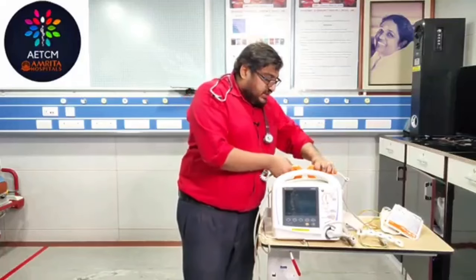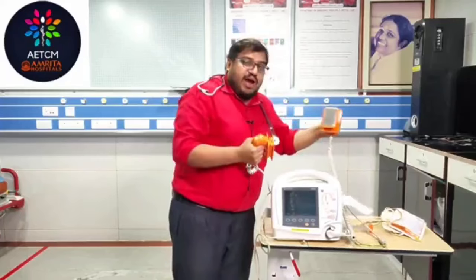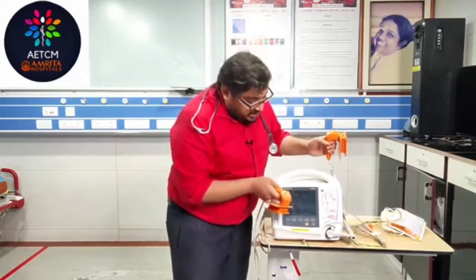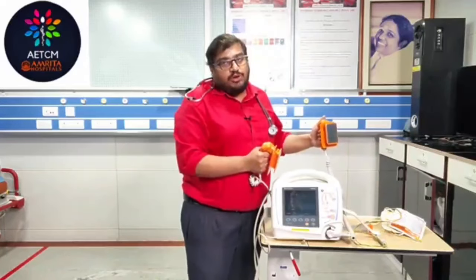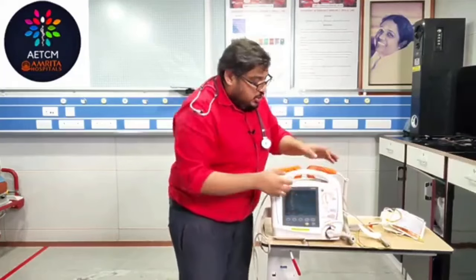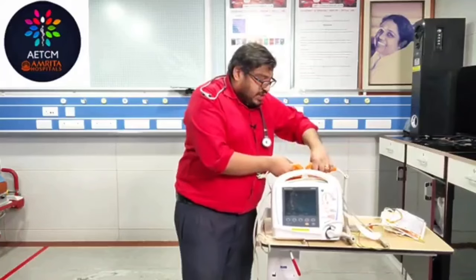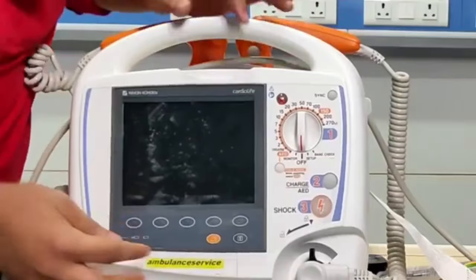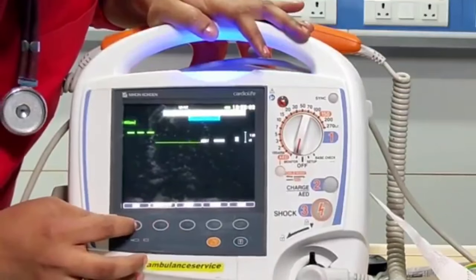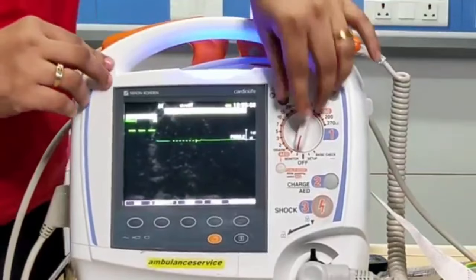And one more additional thing, sometimes you don't find these adhesive electrodes. You can keep the paddles with your gel on the chest wall. The machine will recognize the rhythm, and you can see the rhythm on the monitor, and you can see whether it's a shockable or a non-shockable rhythm. The scenario is that you don't have this electrode. Somebody has misplaced this cable. You only have this machine. Still you can keep this over the patient's chest, and you can see what the rhythm is. The only thing you need to do here, as I have shown you, is select the lead as the paddle. Lead as paddle. So the paddle will give you the details for that.